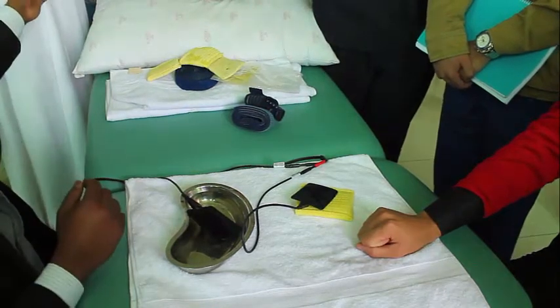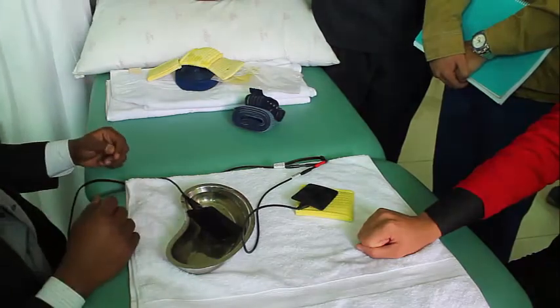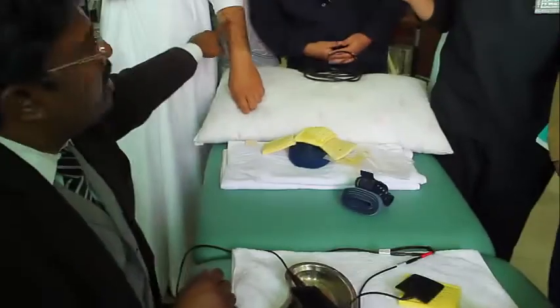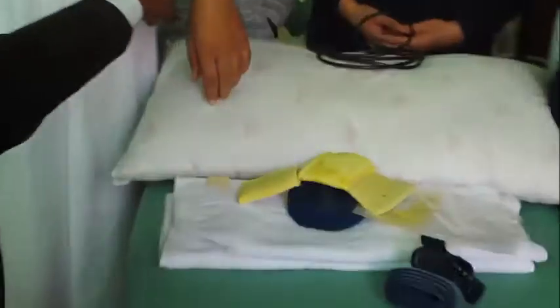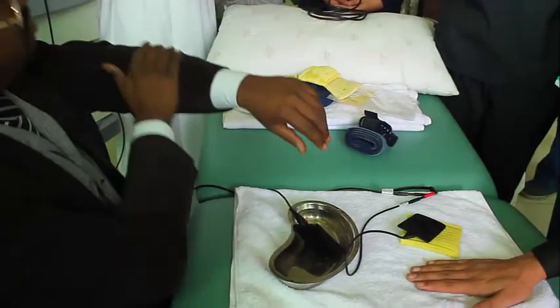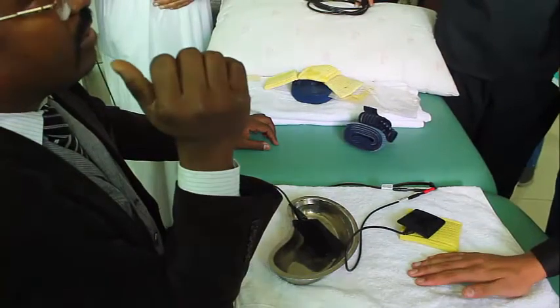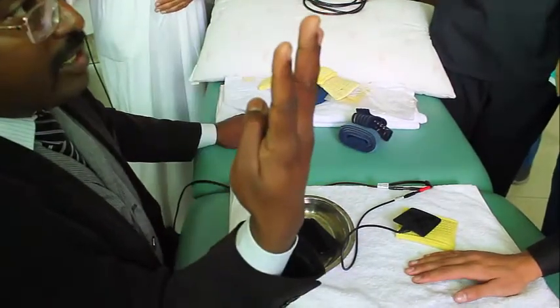How much is the length? See, this much, no problem. Can you open the forearm? Okay, here you have to shave. For more time, for example, if you are using it for 10 weeks, it is better to shave. Your treatment will be good. Okay?